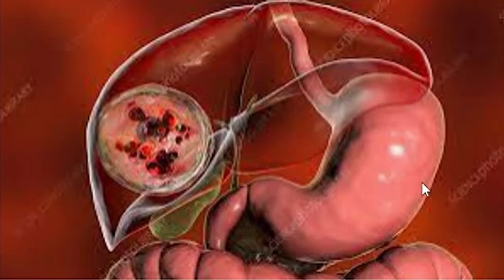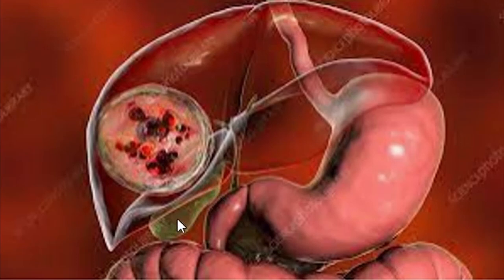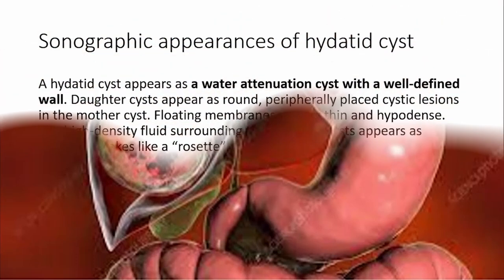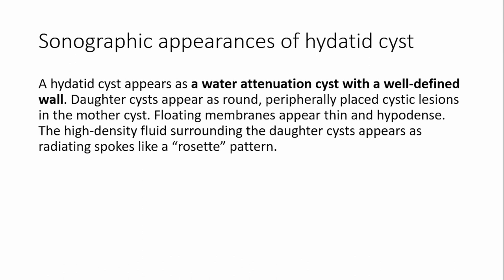Here is our stomach, then our esophagus and the duodenum. You can see the colon — the transverse colon is here. Anatomically, this is our gallbladder. Hydatid cysts have variable sonographic appearances. I am going to highlight some of the sonographic features you are supposed to look at when you see a cyst in the liver.